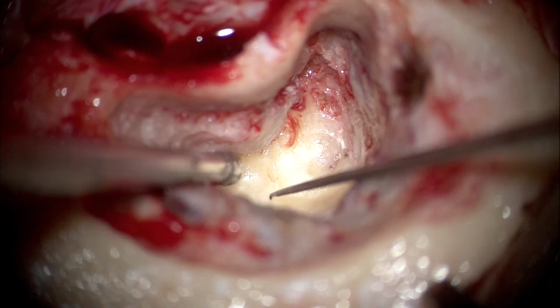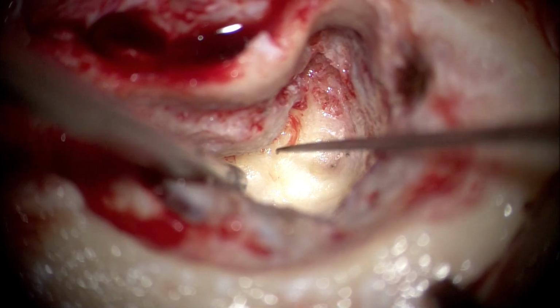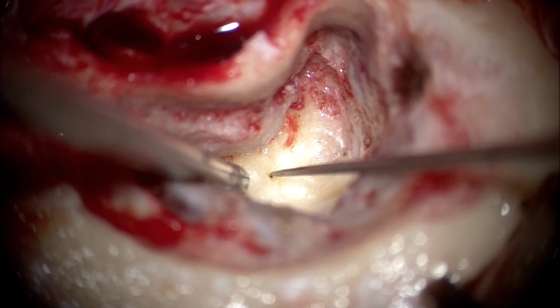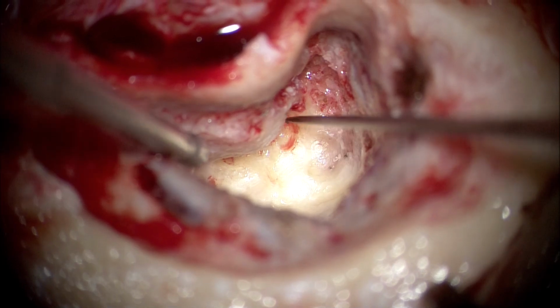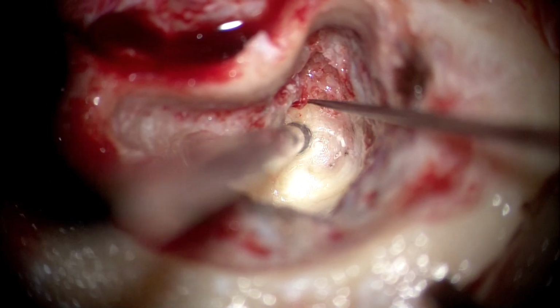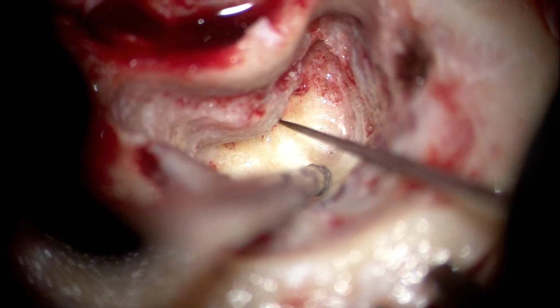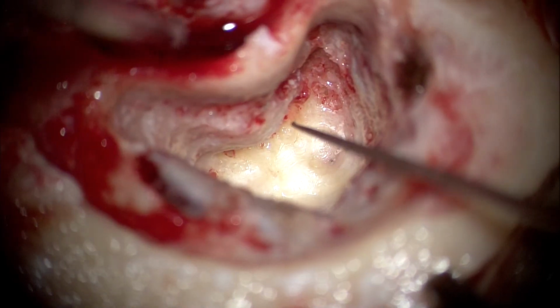So this is again the vestibular aqueduct. You can see a fine shadow against the glare of the microscope going perpendicularly from the vestibule towards the posterior fossa. And most of the epithelium from the vestibule has also been cleared.